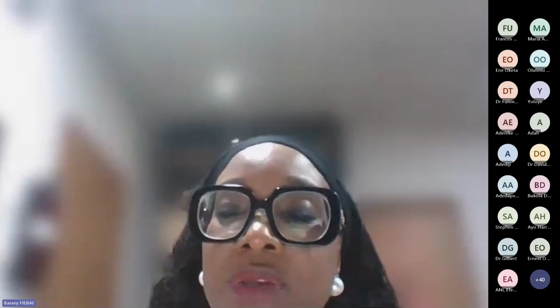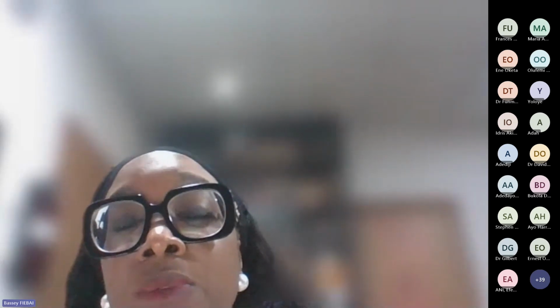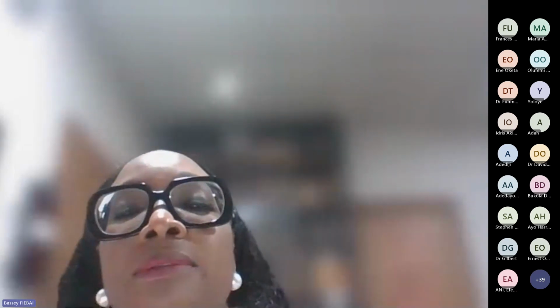So you can have more than 1 or 2 or 3 pathologies in the same patient. So your retinal detachment, the membranous opacity will be attached to the optic nerve, with a very high spike and very limited movement. Your dome-shaped membrane points to a choroidal detachment.